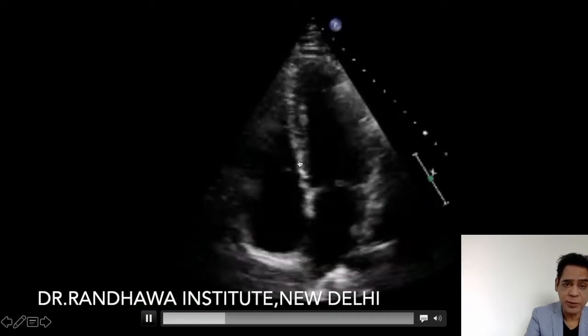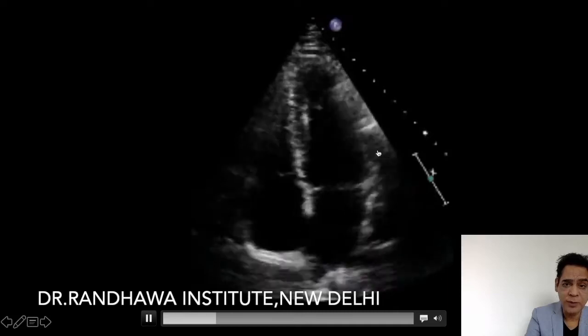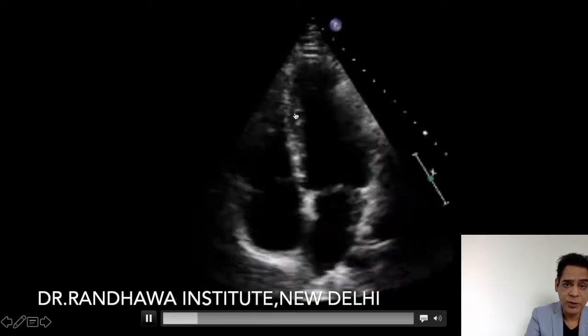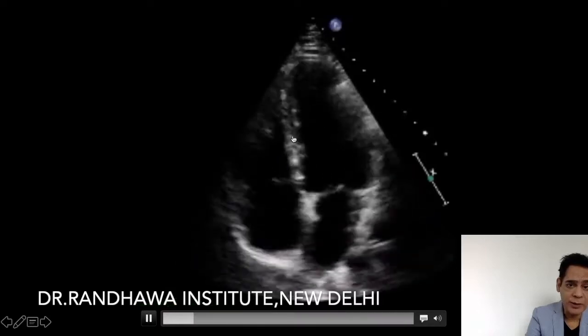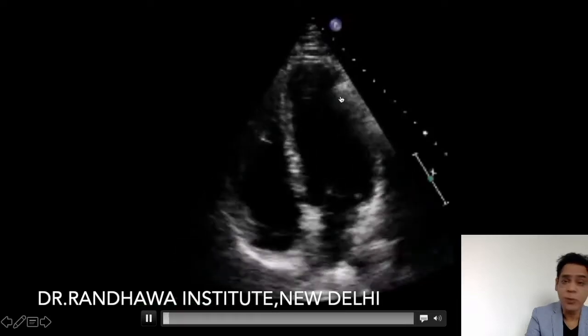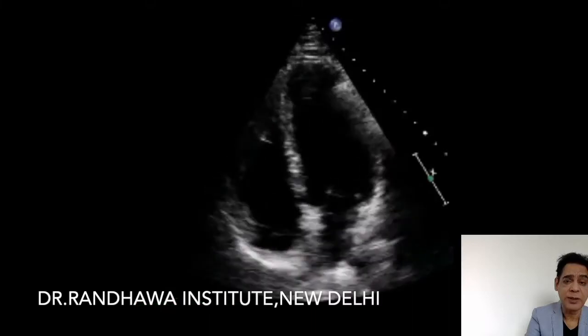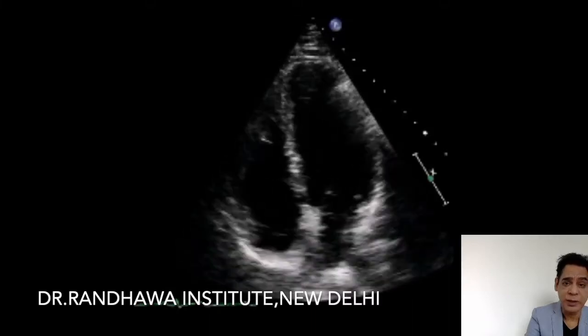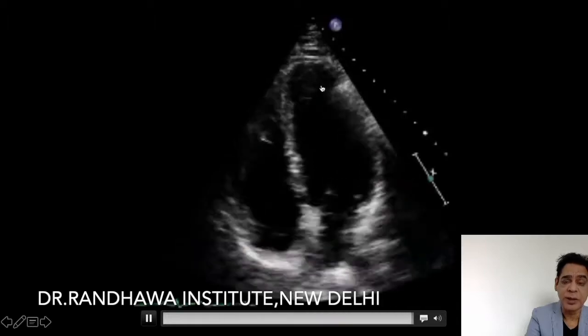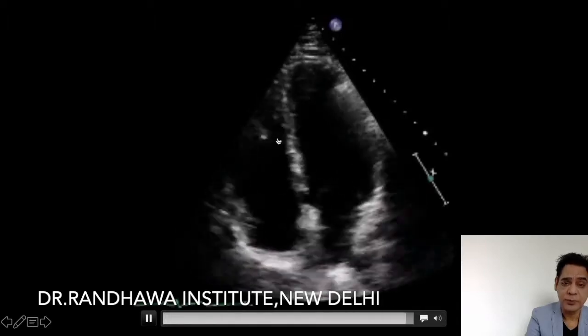You can see it is bullet shaped. You can see these two walls are parallel and gradually they are converging. Now what will happen if they go like this? They diverge and then join. That will give a more globular shape to the left ventricle, and that happens when there is aneurysmal dilatation or when there is any dyskinesia also.